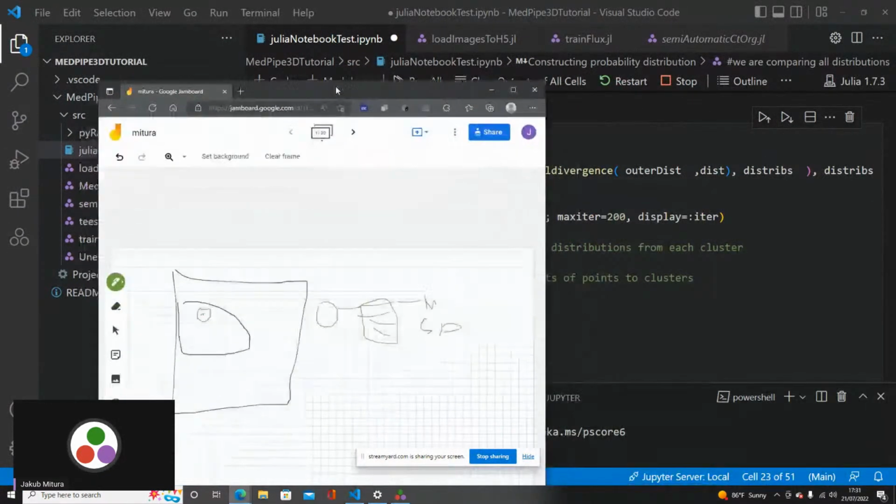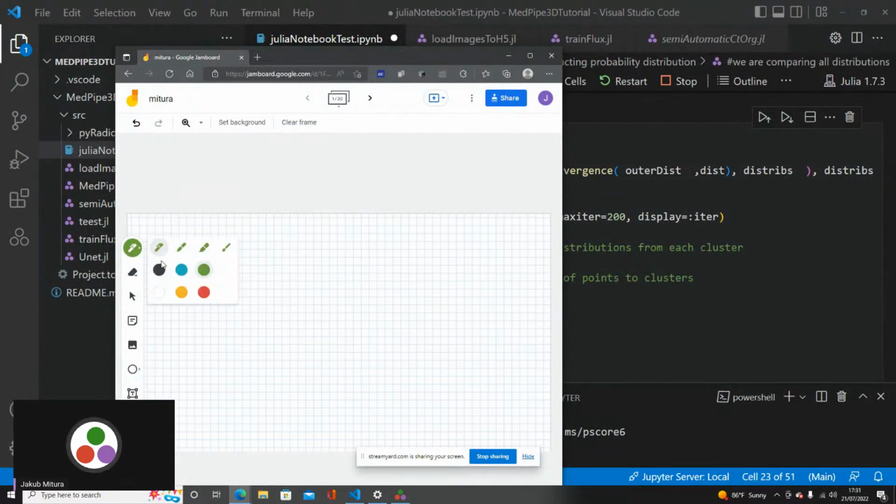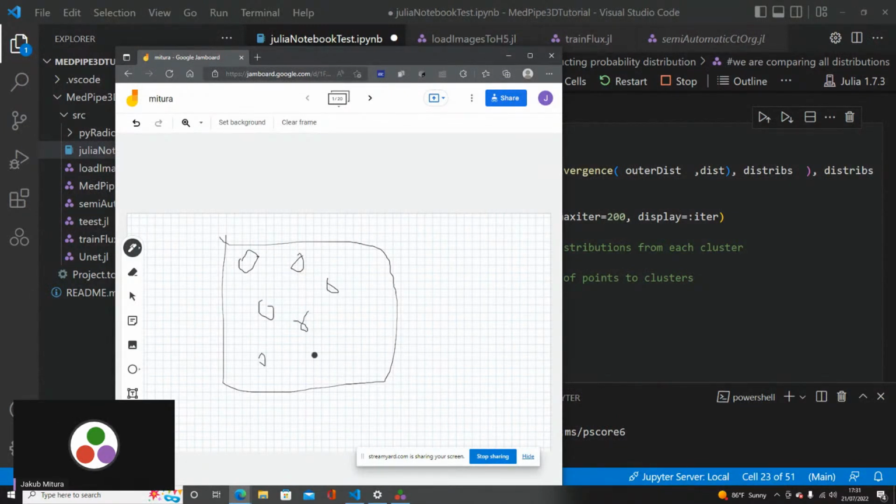Basically, from all of the probability distributions that are present, it compares them using the Kullback-Leibler divergence and checks where each probability distribution is in this space defined by the Kullback-Leibler distance, whether they are similar or dissimilar. The clustering just puts similar distributions in the same clusters.